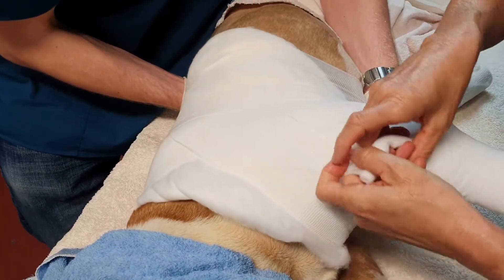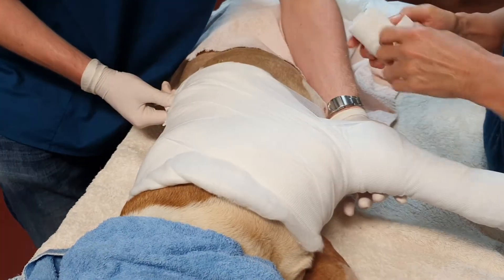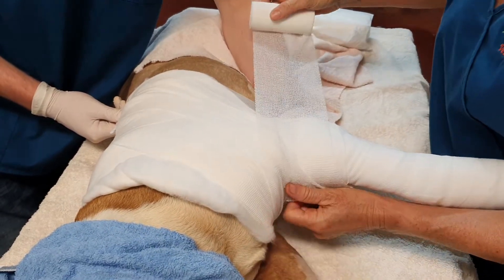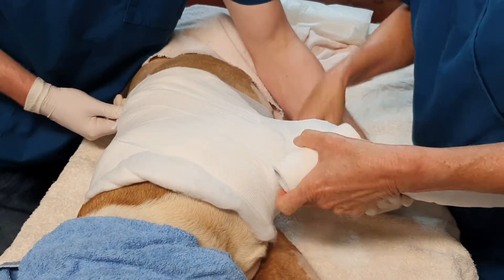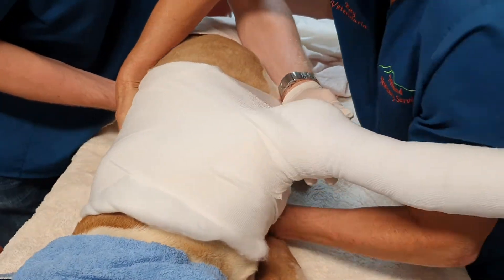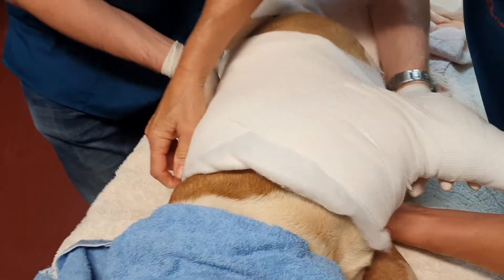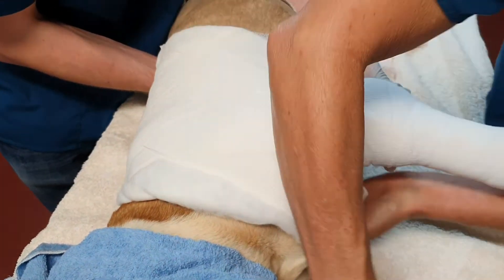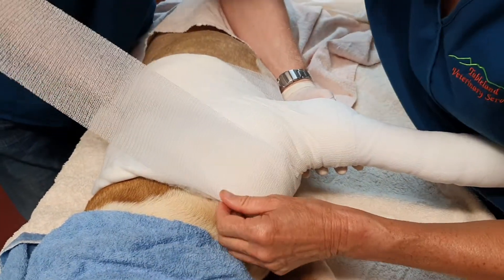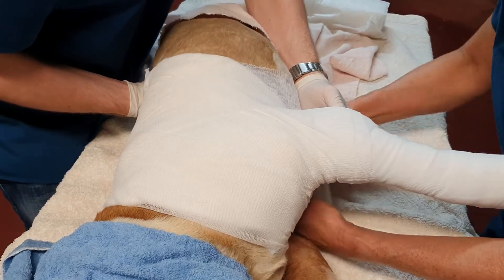This does use a lot of material. When you're doing the estimate, you need to make sure that you estimate sufficient cost for all this material, plus the fact the animal is nearly invariably anaesthetised. I'm adding another roll here. Once I'm happy that I've got good coverage, I'll go looking for any bit I may not have covered, which is the front of the shoulder. Make sure this is not too tight — these animals do have to breathe. I'm quite happy that I've got all my padding well covered with conforming material.